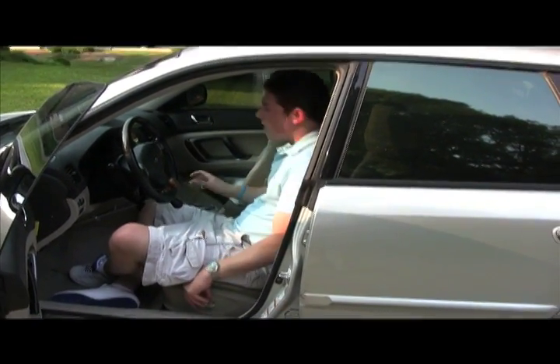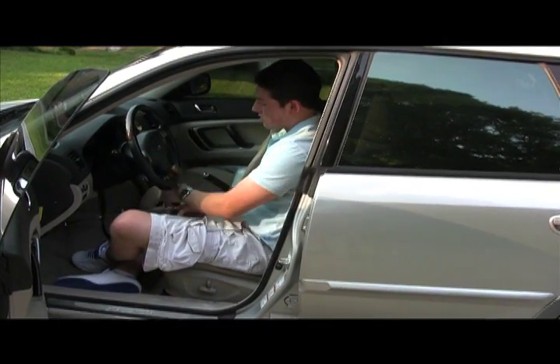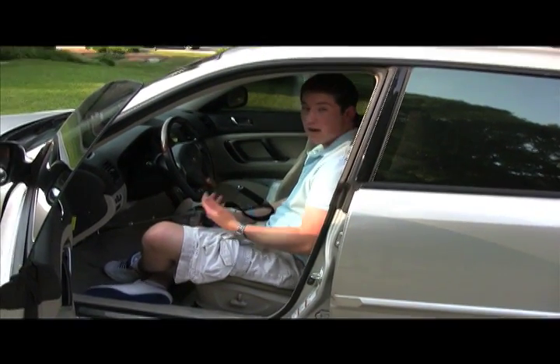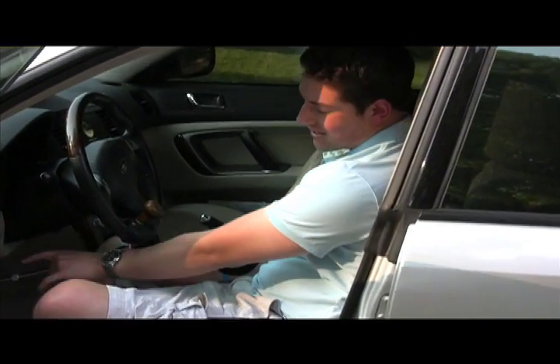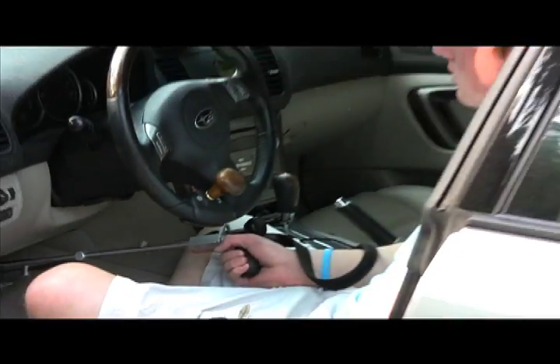All right, now how I operate my vehicle is a pretty simple procedure. There's a lot of different hand controls out there on the market. The one that I use is actually considered to be a travel hand control. Why it's considered to be a travel hand control is because it can easily be taken off of any automatic car and then put in any other automatic car. It makes it great for traveling, road trips, driving your friends' cars, anything like that.